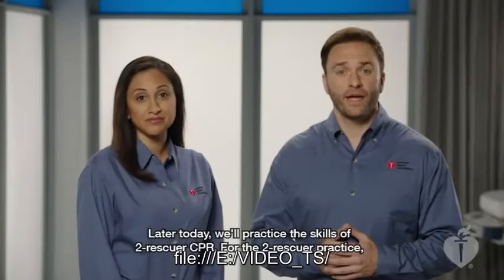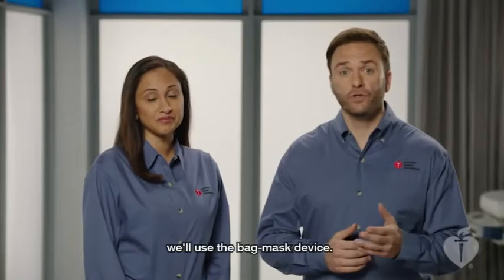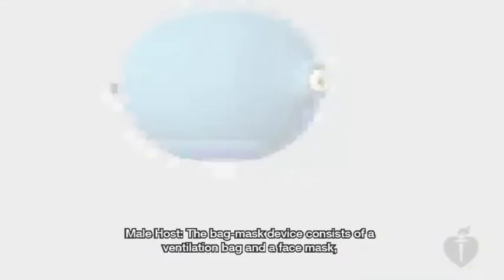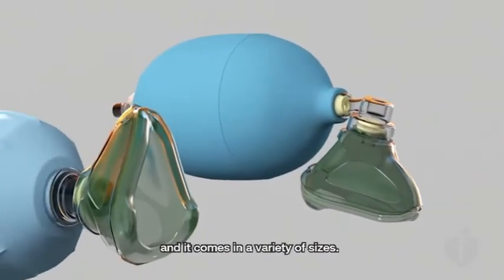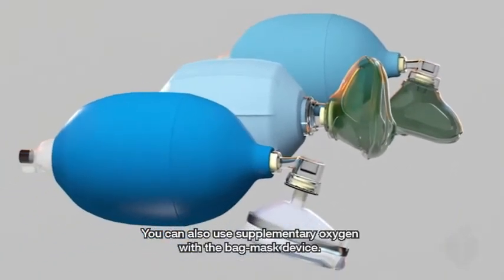Later today, we'll practice the skills of two rescuer CPR. For the two rescuer practice, we'll use the bag mask device. So let's first learn how to use it. The bag mask device consists of a ventilation bag and a face mask, and it comes in a variety of sizes. You can also use supplementary oxygen with the bag mask device.